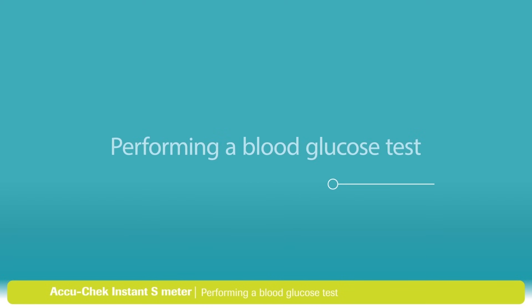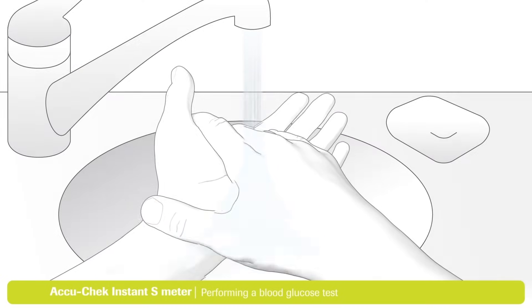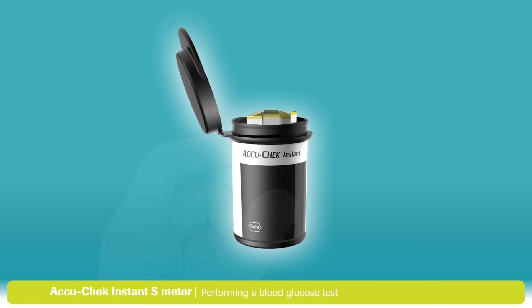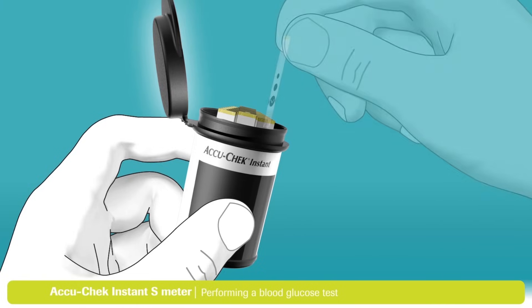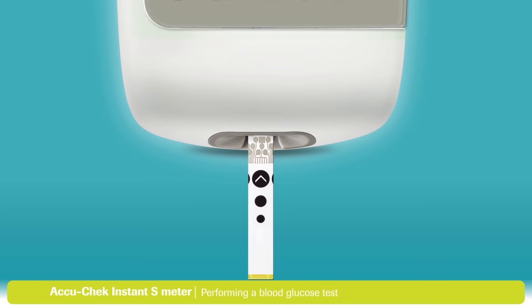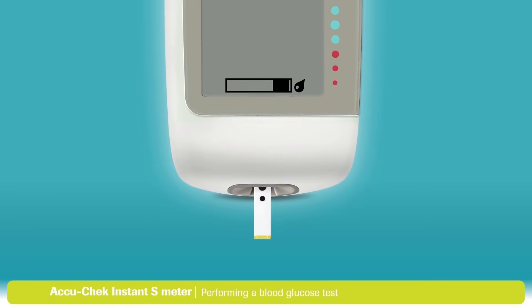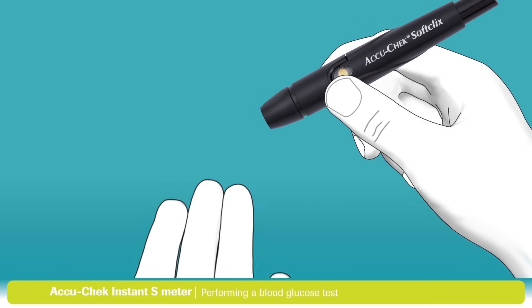Now you're ready to do a test. First, choose a finger to take a sample from — it's best to alternate between fingers as they can become sensitive over time. Remember to always wash your hands with warm soapy water and dry them thoroughly before you test. Remove a test strip from the container and always close the lid tightly to protect the remaining strips. Insert a fresh test strip, metallic end first, into the meter — the arrow in the black circle indicates the right direction. The meter will turn on automatically and a flashing blood drop symbol will appear on the display.